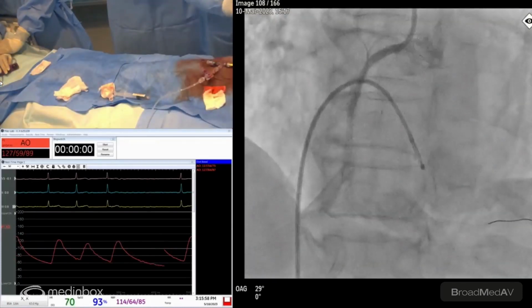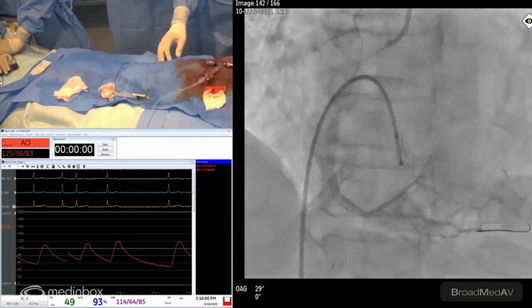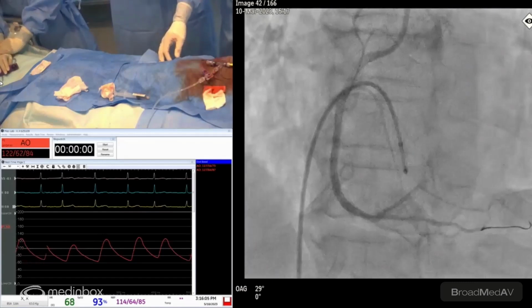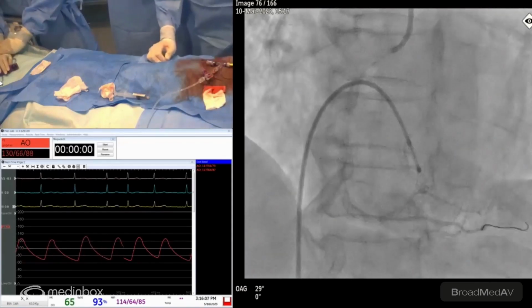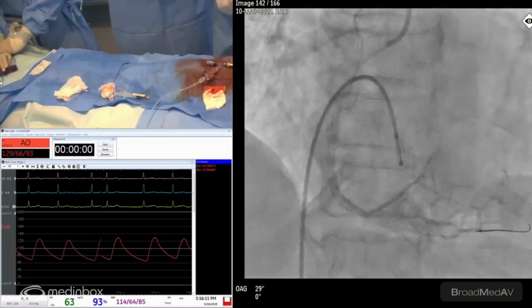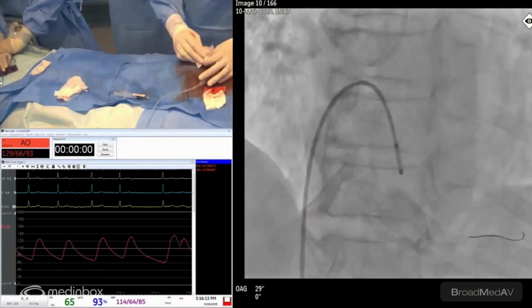Usually when I use stiff pacemakers in rotablator, I like to monitor the patient post just to make sure, because I've had a few surprises in the past, and it's never good after anticoagulation and heparin, right? To have to drain a tamponade. It's never fun. No, you're right.